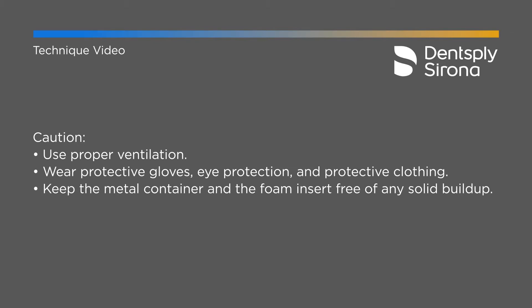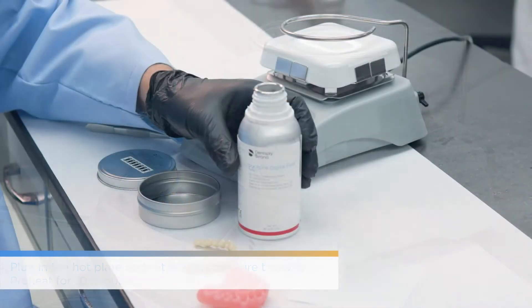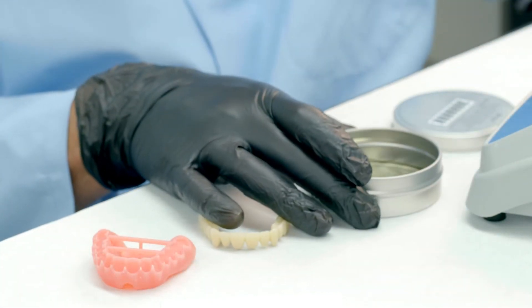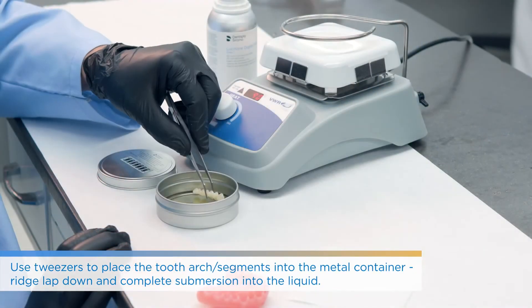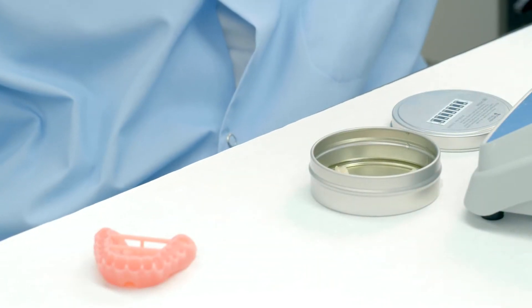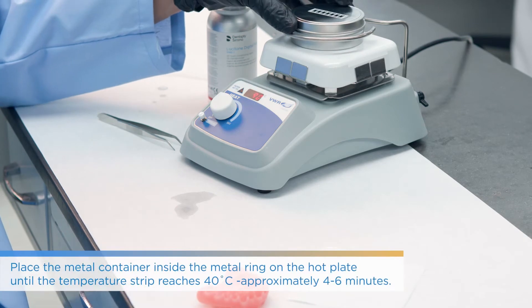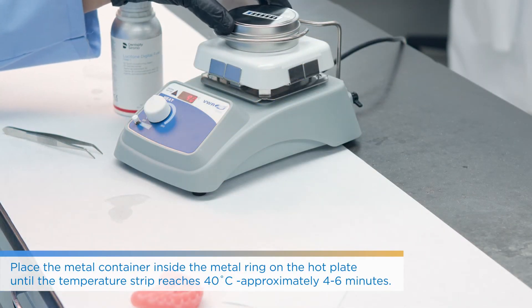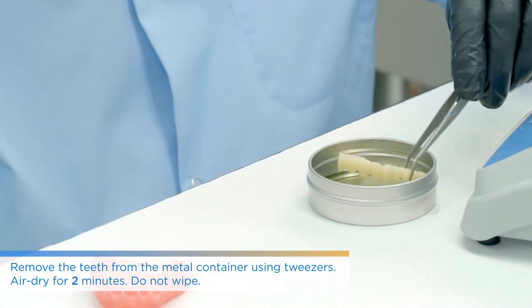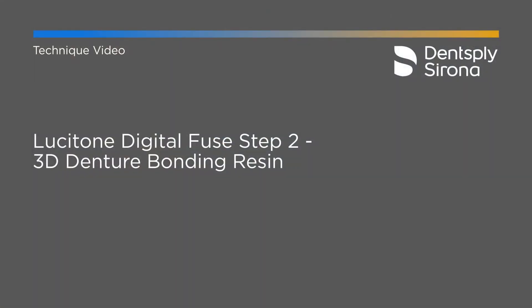You will still use Fuse Step 1 because we're dealing with a premium tooth — the Dentsply Sirona multi-layer PMMA. Get the heating plate to 90 degrees and place Fuse Step 1 into the metal container. For multi-layer PMMA, since you won't have individual teeth, remove the blue foam piece and just submerge the intaglio surface down, making sure that area is completely submerged in Fuse Step 1. Put the lid back on and place it onto the heating plate. Again, 40 degrees Celsius — roughly 4 to 6 minutes — and pay attention to the green marking on the temperature gauge sticker to ensure you reach the proper temperature but not too high or too low.